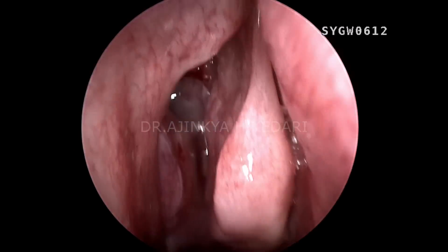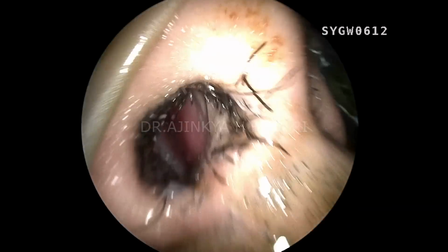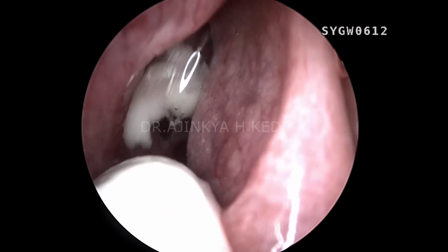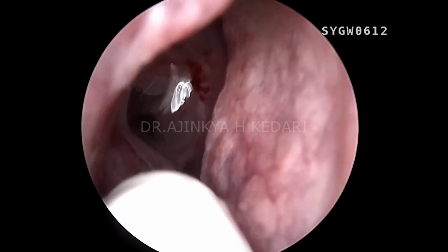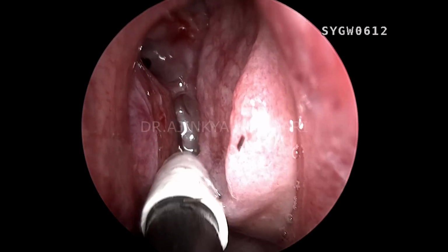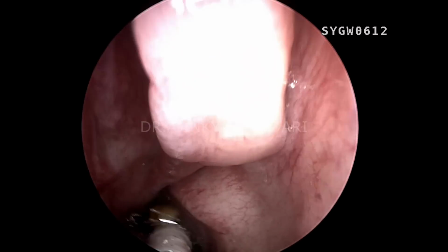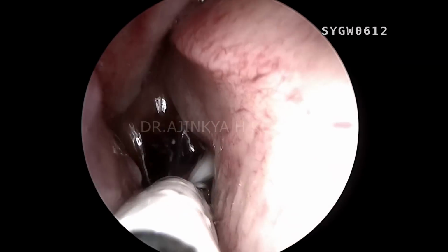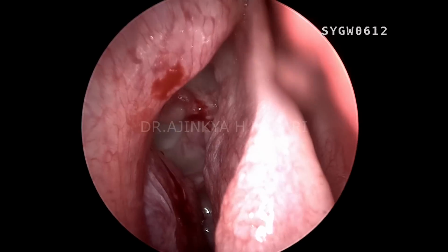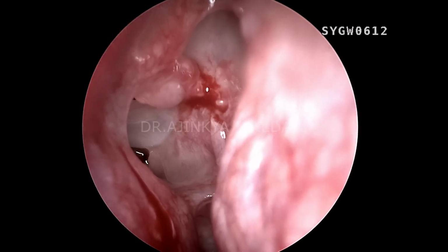As per the scans, we could see that there is a defect in the posterior wall of the frontal sinus. You can see that's the pus all around. There's possibly one more defect in the posterior ethmoidal skull base as such. So there are 2 possible defects as per the scan reports, which we could see. You can see I'm giving a nasal wash, taking out all that debris, clots, and the mucopurulent secretions.